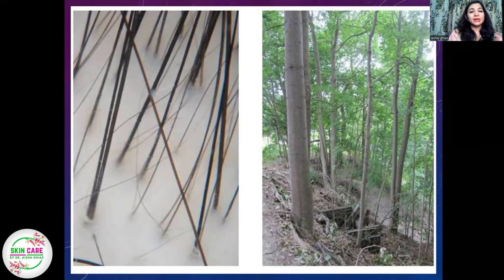And if you see with a little bit more focus, you can see that there is different caliber of different hair follicles. Some of them have gone through the miniaturization process and they are kind of very thin, while others are of middle caliber and some of them are quite thick. So there are different calibers in this trichoscopic picture.